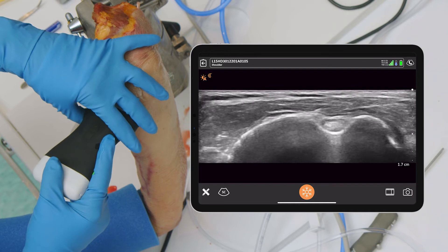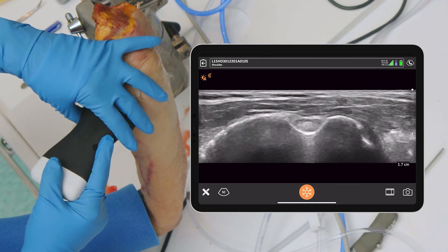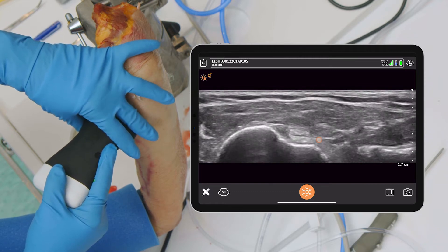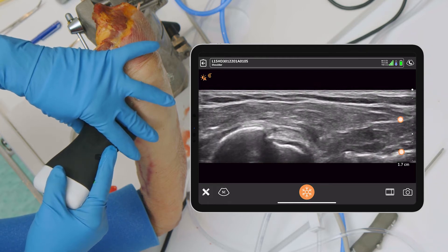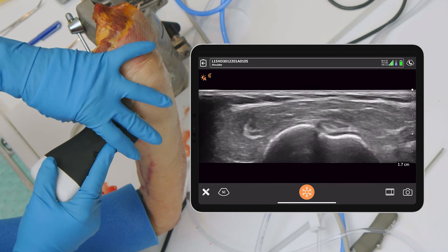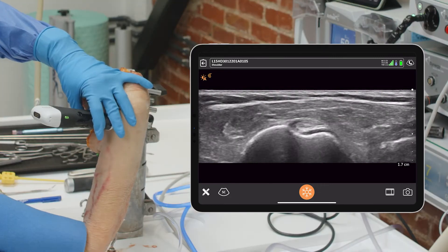Here's the thing: if we look superiorly, we see the biceps and we see the groove. If we follow it down, you see it flattens out, exits the groove, and then we start seeing the pec arrive. So we need a spot between that pec and that notch — which is right there. That's the spot we want to be in — not where the pec is and not where the notch is.